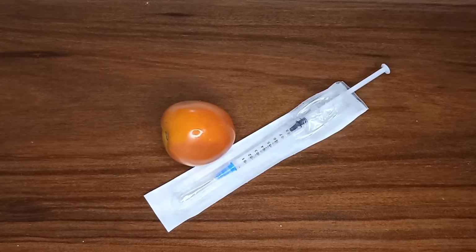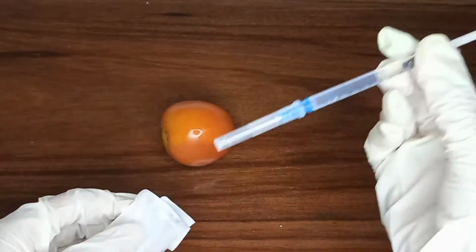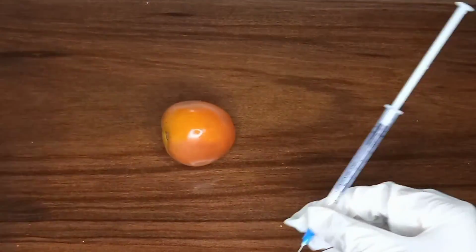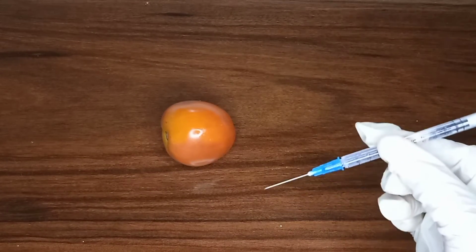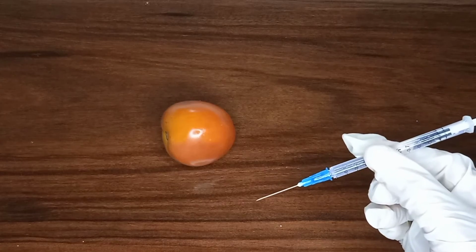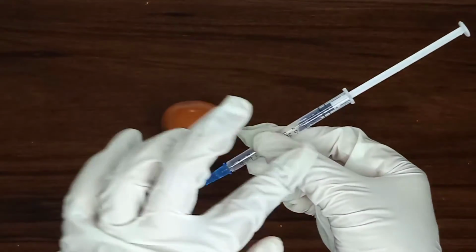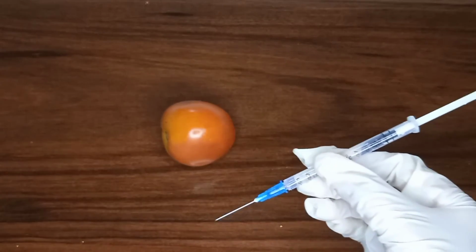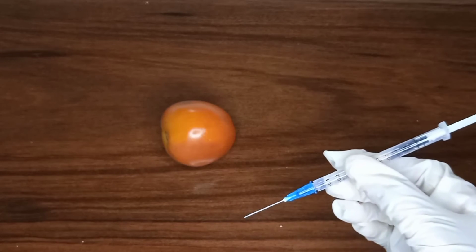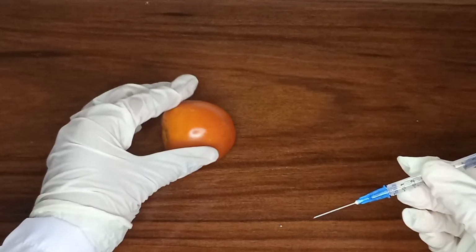Next, we are going to remove the needle cap by pulling it straight off. After removing, we are going to hold the syringe between our thumb and forefinger of our dominant hand. Then we are going to pinch the skin with our non-dominant hand. So as if this is a skin, I'm going to pinch it.